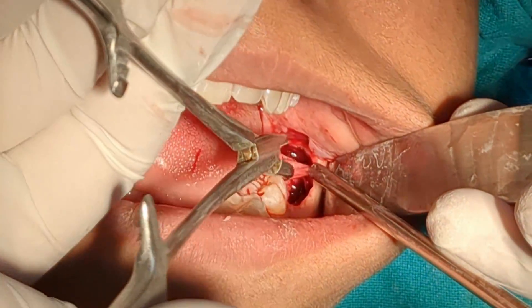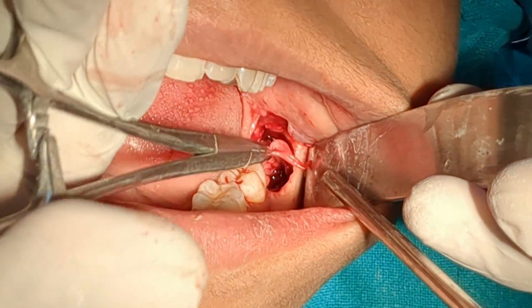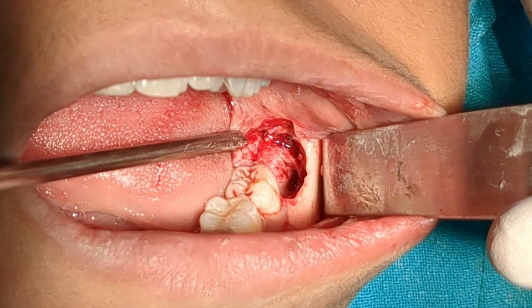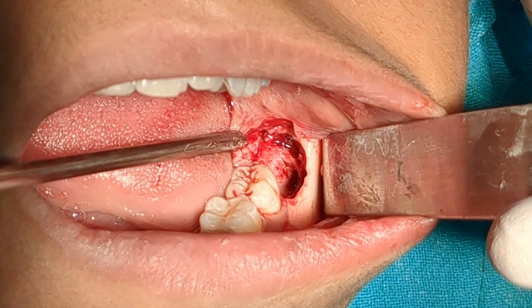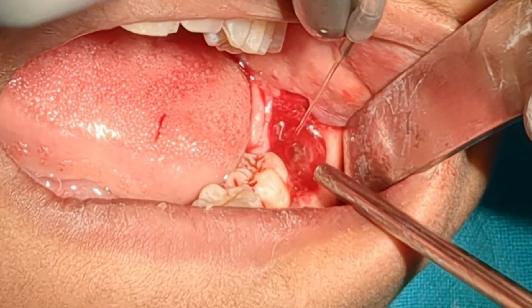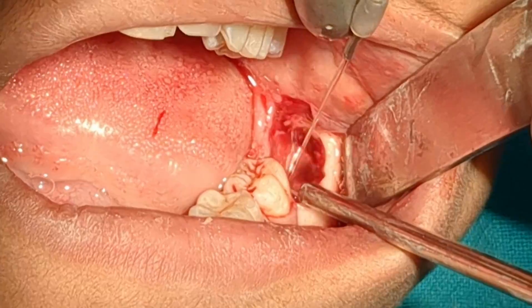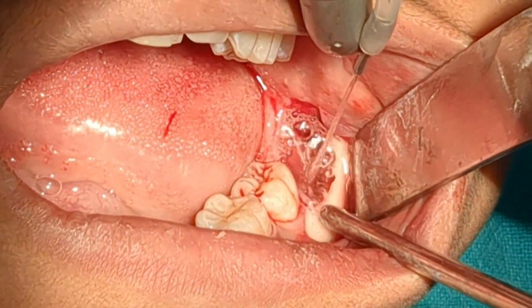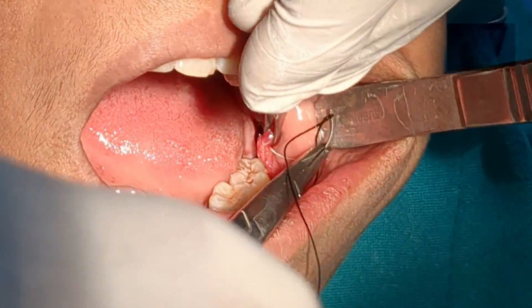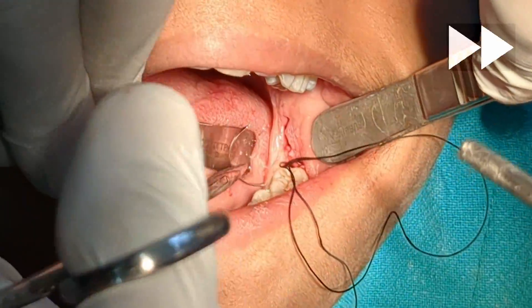You can see there is a dental follicle present in the socket. I hold it with an artery forcep and cut it with a number 15 blade. This is how the socket looks after tooth removal. I then irrigate the socket with normal saline under high pressure to force out any debris that may have fallen inside during the procedure. I then close the flap with two simple interrupted sutures.